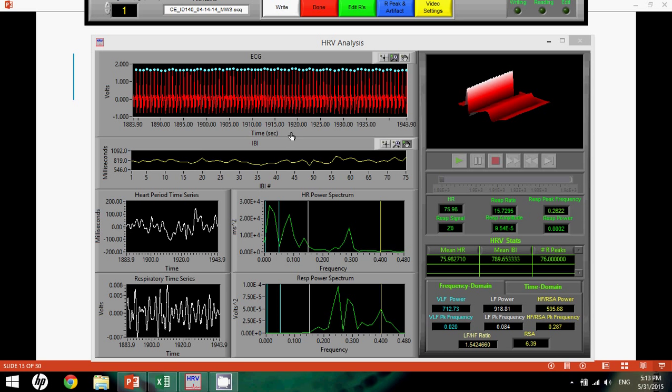The second module down here, the IBI, basically tells you any kind of variation from R to R spike. So in this case, you see like a slight peak right here. This essentially means that you have slightly more of an increase between the R spikes in this particular area, and you'll see this variation throughout. It's not an issue that you have the variation.